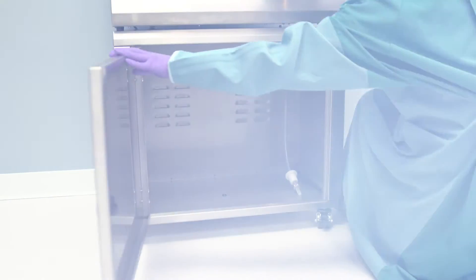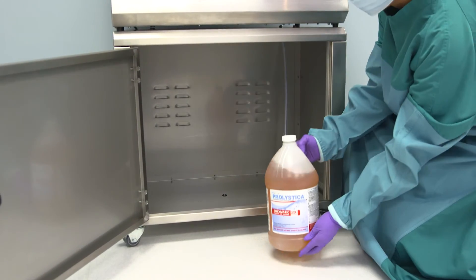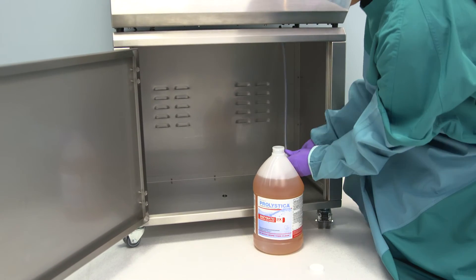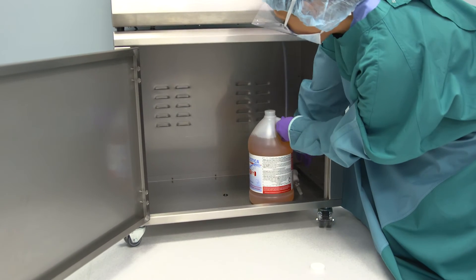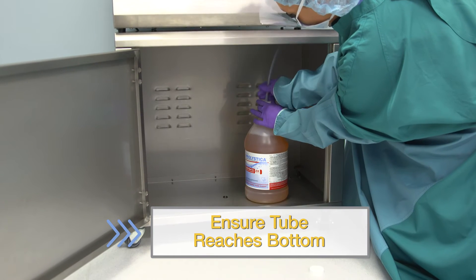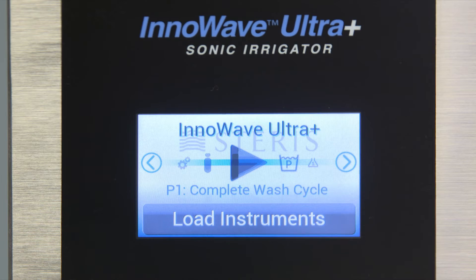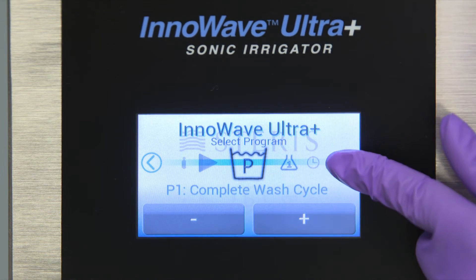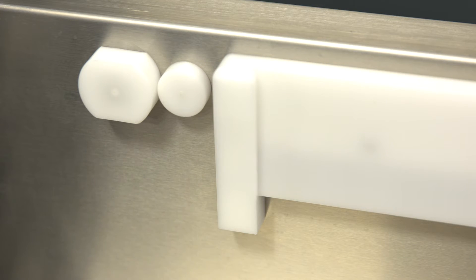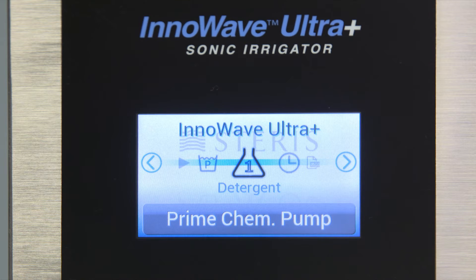You will need to hook up chemistry before using your ultrasonic. At initial install and every time chemistry is being changed, the lines need to be primed to ensure proper dosing and prevent cycle errors. Prime the lines by placing the chemistry pickup tube in the new chemistry bottle, making sure it reaches the container's bottom. Use the arrow keys to locate and select the chemical pump icon. Press the Prime Chemical Pump button to begin priming. Look inside the chamber at the chemistry inlet. Once you observe chemistry coming into the chamber, press the Prime Chemical Pump button again to end priming.